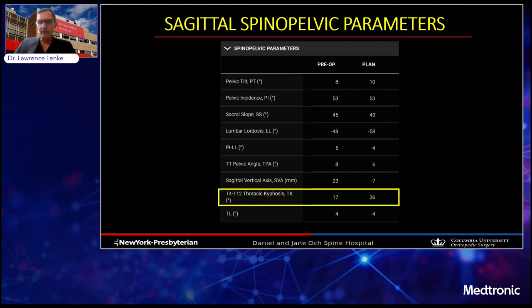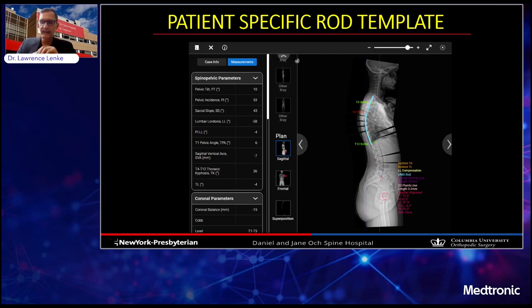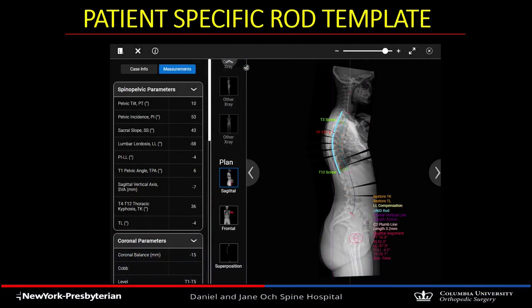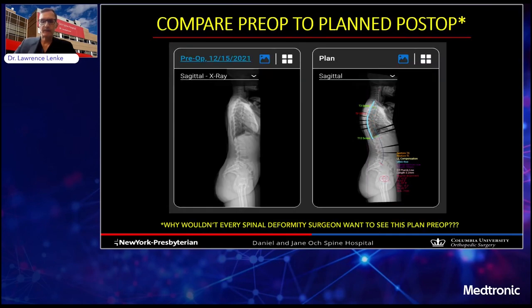With knowing there's only going to be a little give in the rod, I'm actually going to have a rod created with a little more kyphosis than 36 degrees — probably around 40 to 45 degrees — because even with a 6.0-millimeter cobalt-chrome compressed rod, we'll still lose a little kyphosis. Here's the pre-op planning: the rod is simulated, and to me this is one of the best features — even having done deformity surgery for 30 years, I still like seeing exactly what the reconstructed sagittal plane will look like, including the spontaneous correction expected in the lumbar region below.